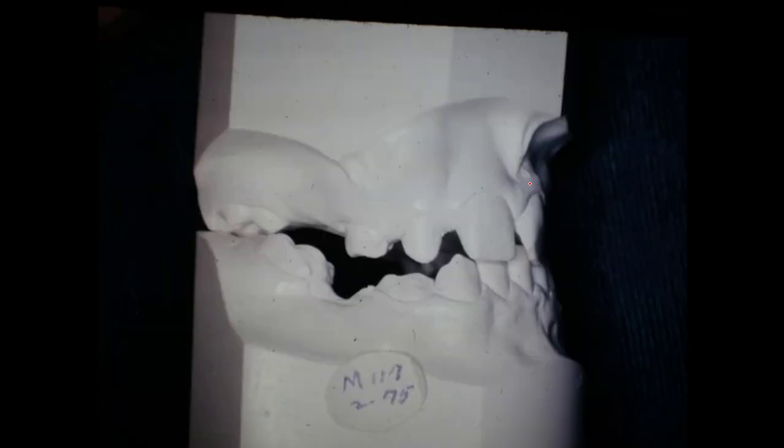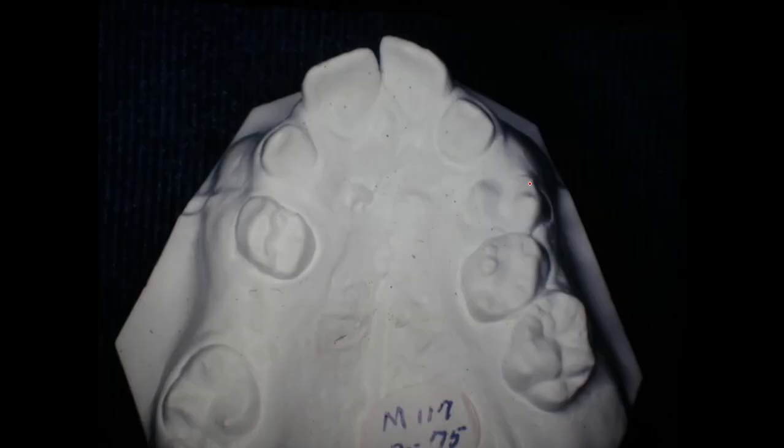I didn't know what on earth I could really do, but I knew that I had to expand this arch, both upper and lower. We expanded the upper and the tongue got her functioning correctly. It looks like she was kind of a mouth breather to start with. The lower arch is wider than the upper arch, and the upper arch is very narrow.